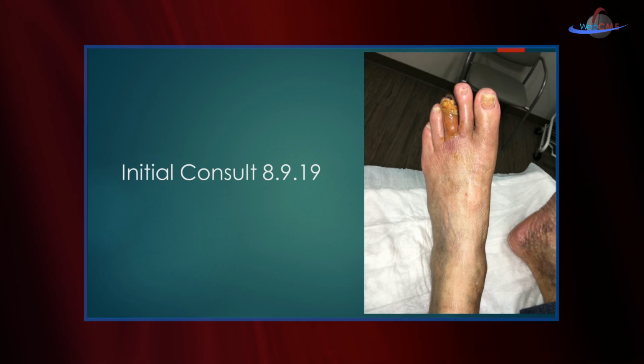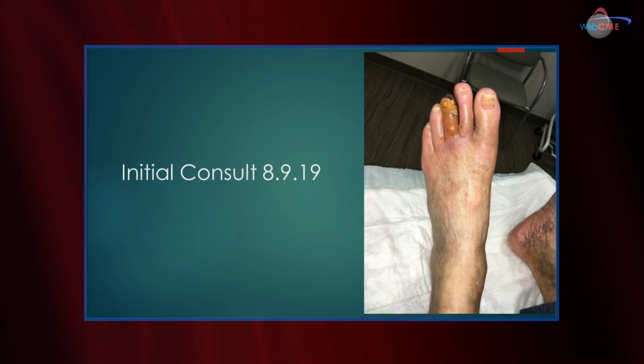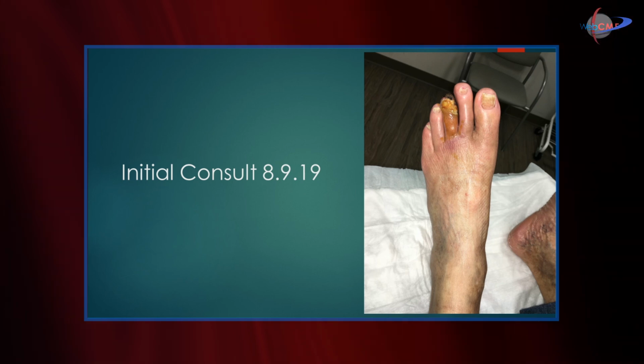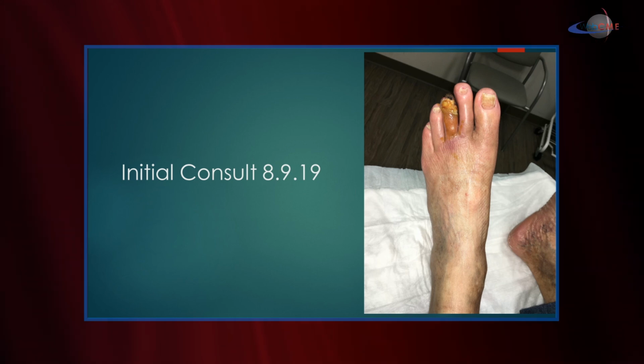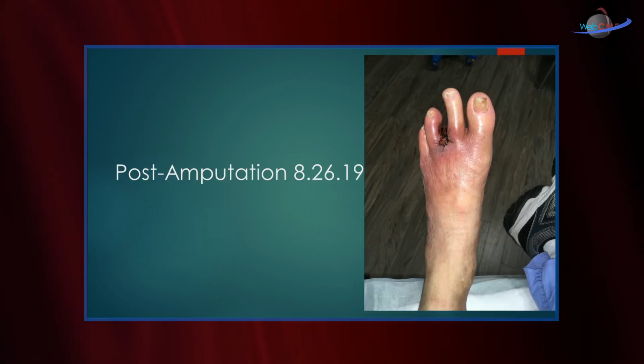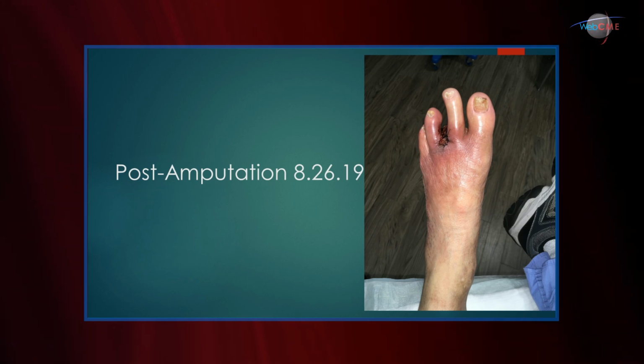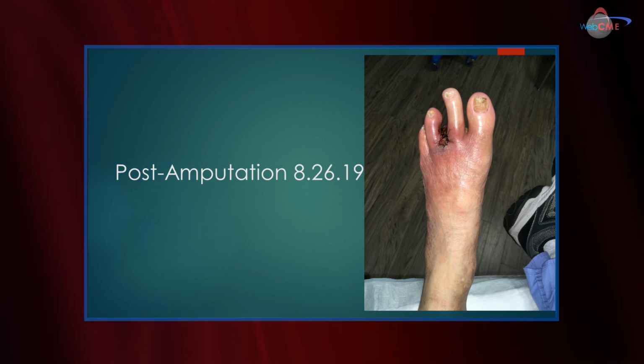This insight revolves around a patient, his initial evaluation, and some of the therapy that he received here at AZH. We saw him in initial consultation, and he presented with a gangrenous left third digit, as you see here. He came to us having had vascular intervention, and he was billed as being vascularly maximized. So he was sent to one of our expert podiatry consultants, colleagues, and underwent a toe amputation a few days after that initial presentation. If you look at this photo, you can see that he has significant necrosis of the incision with significant ischemic change around the entire wound.